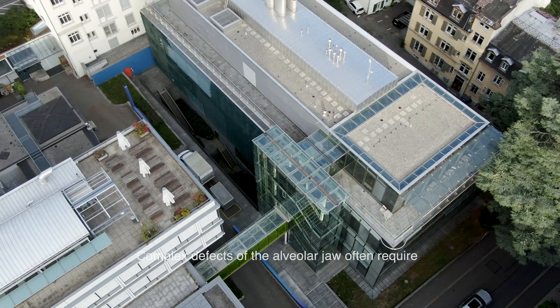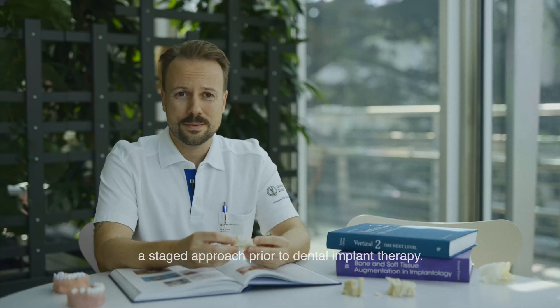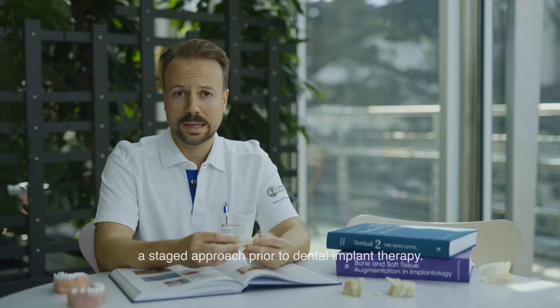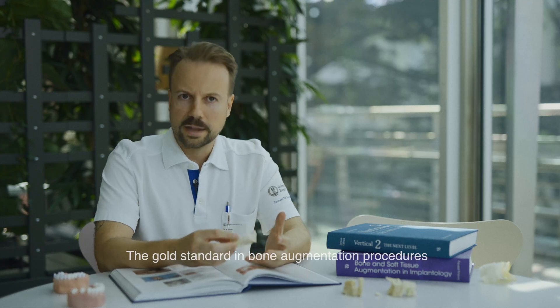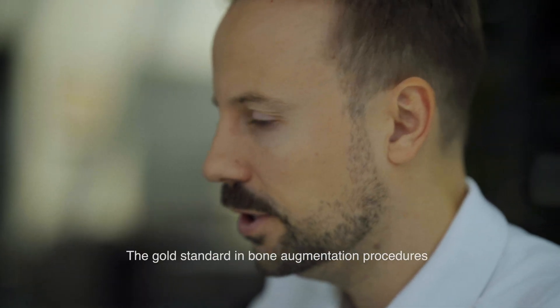Complex defects of the alveolar jaw often require a staged approach prior to dental implant therapy. The gold standard in bone augmentation procedures is autologous bone.